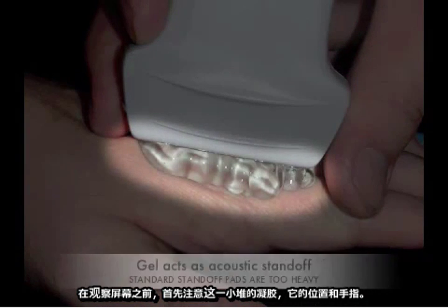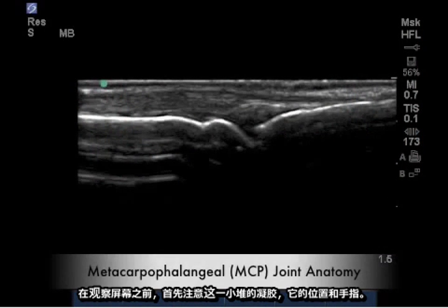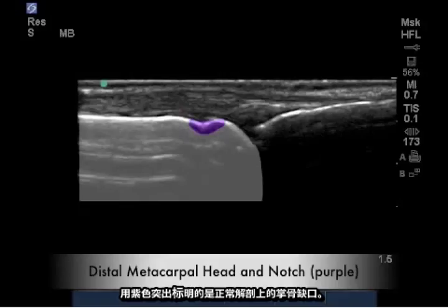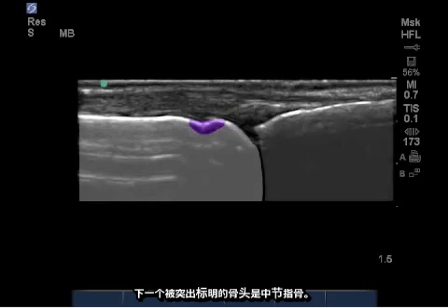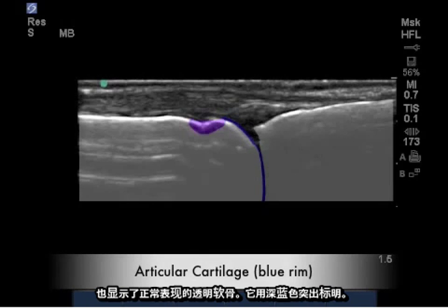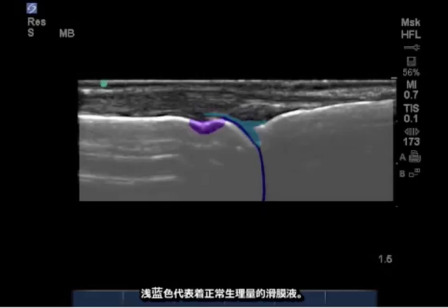Try first to observe the gel heap and the position of the fingers before looking at the screen. Our first observation, highlighted here in white, is the distal metacarpal head, and highlighted in purple, the normal anatomical metacarpal notch. The next highlighted bone is the proximal phalanx. Note the joint space in the normal image also reveals a normal appearing hyaline cartilage, highlighted here in dark blue. The light blue indicates the normal physiologic amount of synovial fluid.